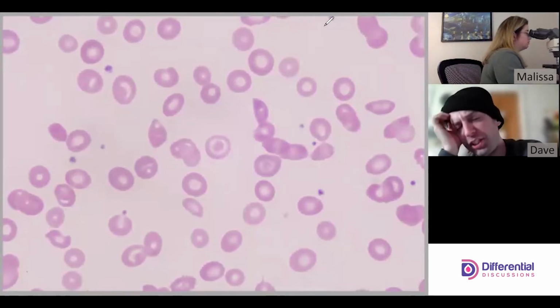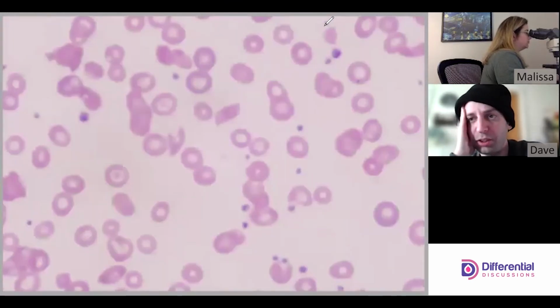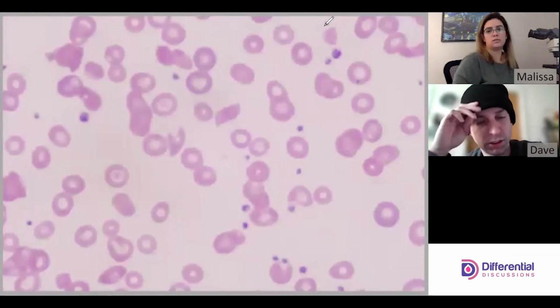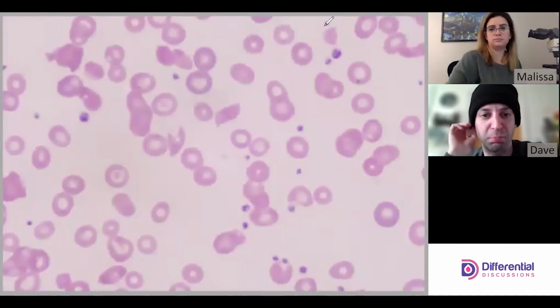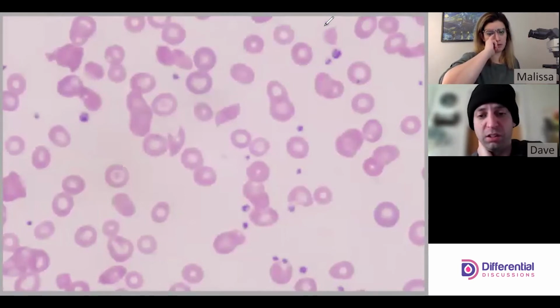Other things you can see too, not uncommon to see nucleated red blood cells, especially in pretty severe crisis. Yep. As the bone marrow responds to its EPO signals, it'll start pushing out NRBCs. So far, none, but. Yep.